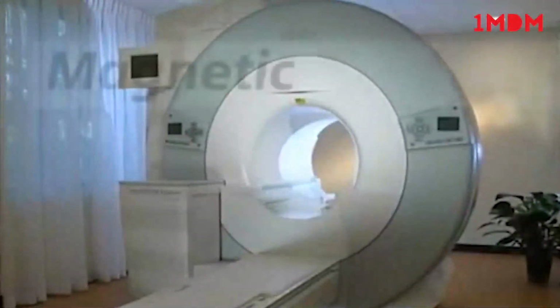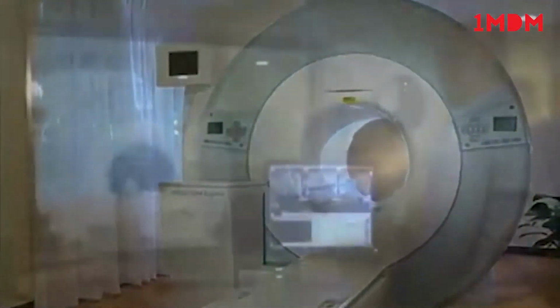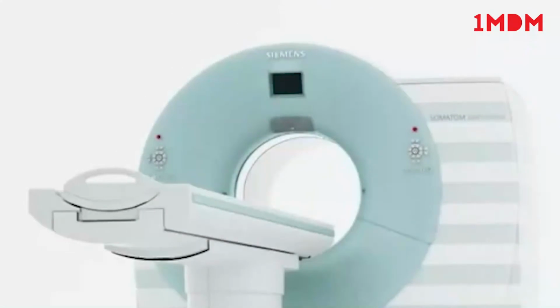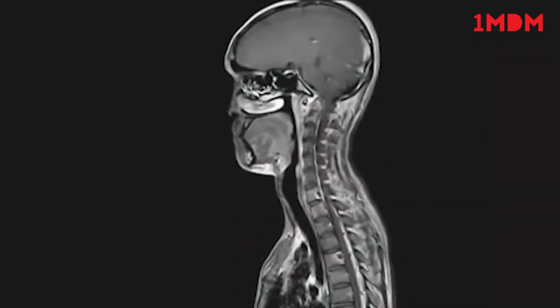Magnetic resonance imaging, abbreviated as MRI, is a diagnostic method for generating cross-sectional images of the human body. This method is based on the interaction between the human body and externally generated magnetic fields. In contrast to computed tomography, CT, MRI does not use ionizing X-rays, but uses static as well as slowly and quickly varying magnetic fields.